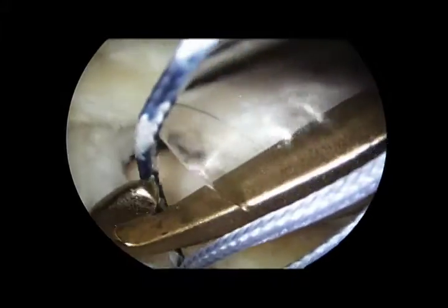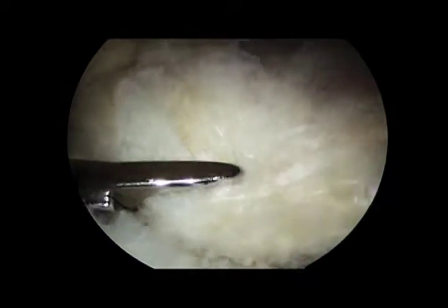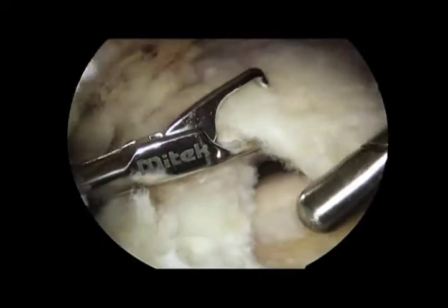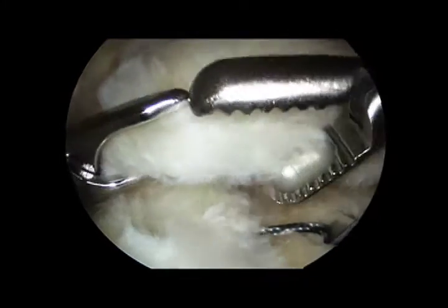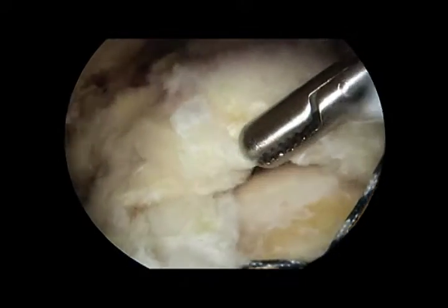The partner limb of the posterior suture is then retrieved at the anterior cannula. Grasping the posterolateral corner of the supraspinatus tendon, the degree of tension is again assessed with reduction of the tendon down to the lateral tuberosity. After the prior necessary debridement of the degenerative cuff edges and the preparation of the tuberosity, reduction of the tendon down to the far lateral footprint would be non-anatomic and result in excessive tension.